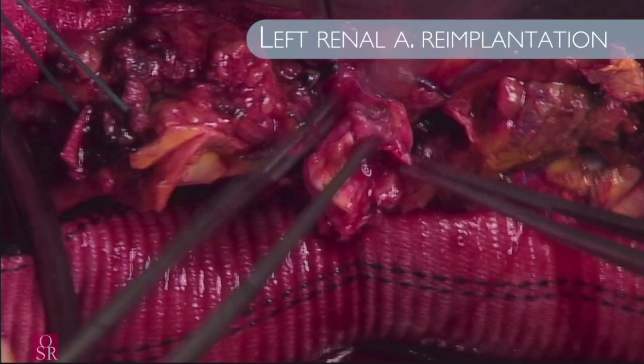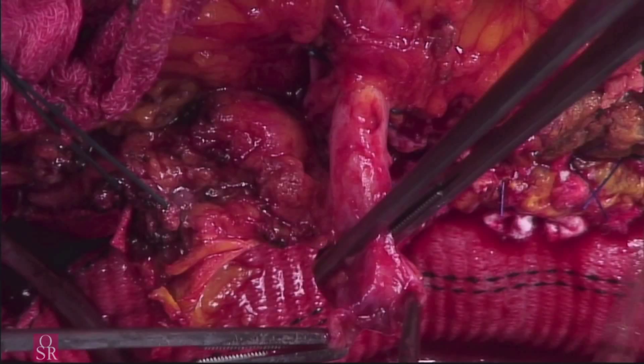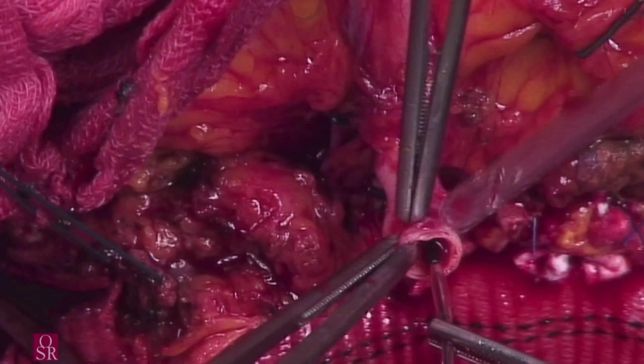When severe occlusive disease is present at the origin of the left renal artery, an endarterectomy is performed before reattaching the artery. The use of intraoperative stenting is very useful to fix the intimal flap in case of unsuccessful endarterectomy. Here is an example of a left renal artery treated with an endarterectomy followed by direct stenting with good result.